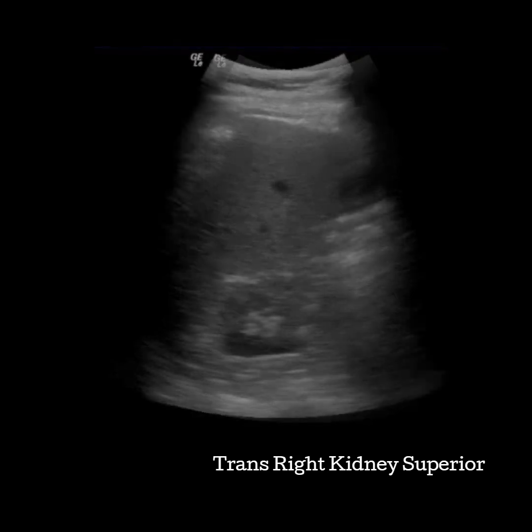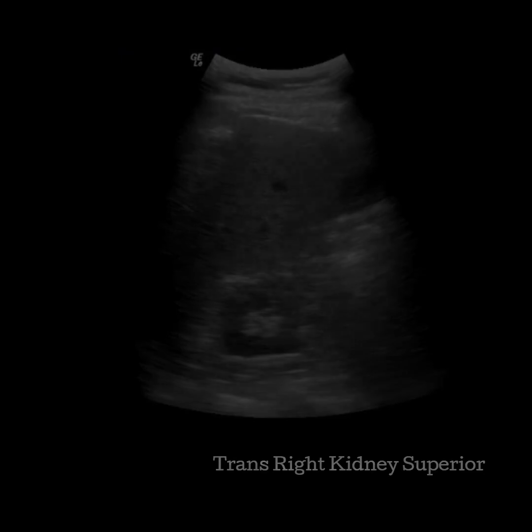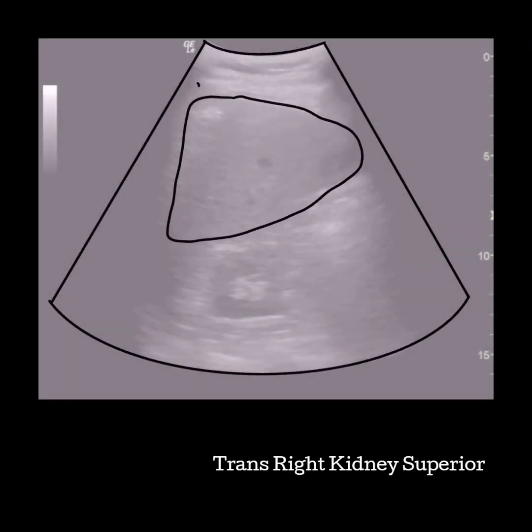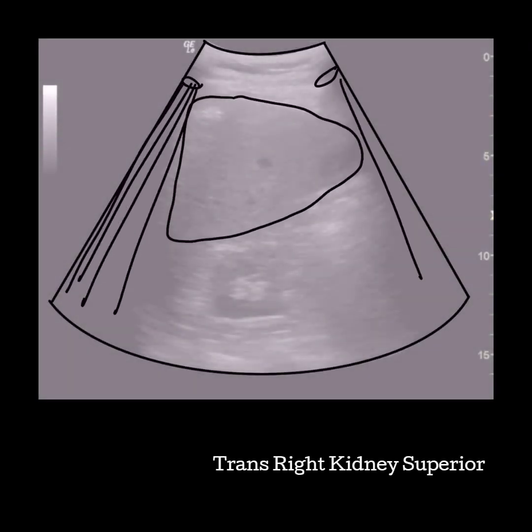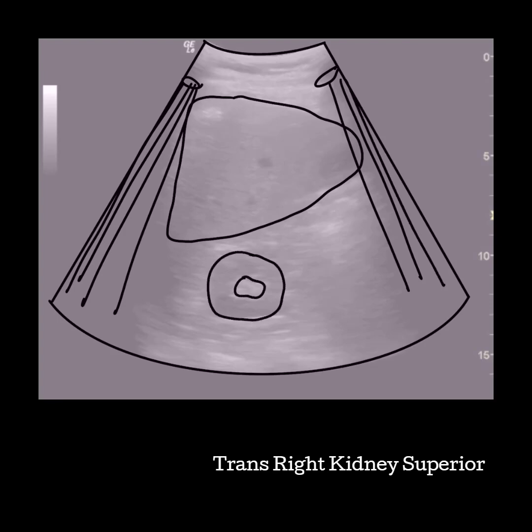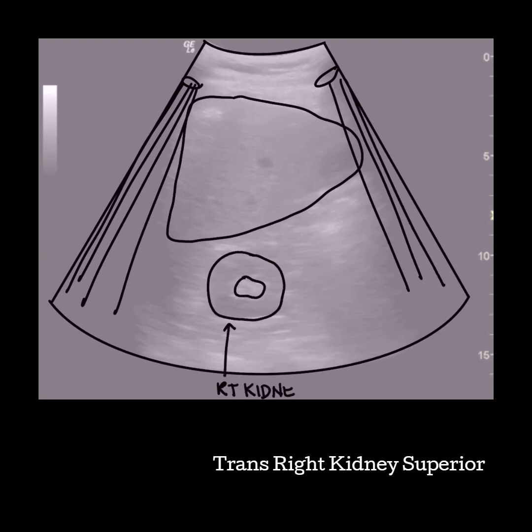Both of these images are appropriate for the superior kidney. To image the right kidney, try using the liver as a window — that will help you to identify the superior pole as well. Make sure that it is nice and rounded. It is appropriate to sector in on your transverse kidney.